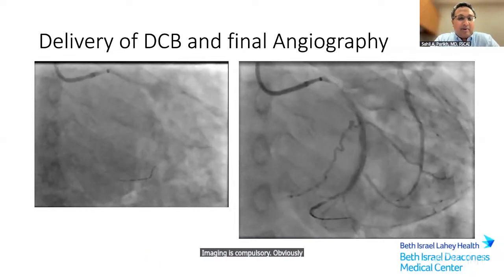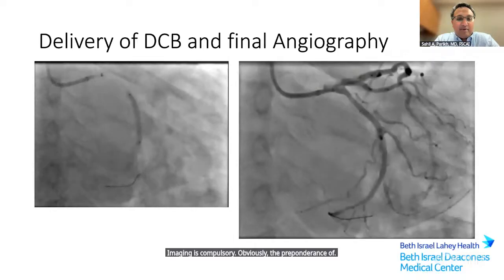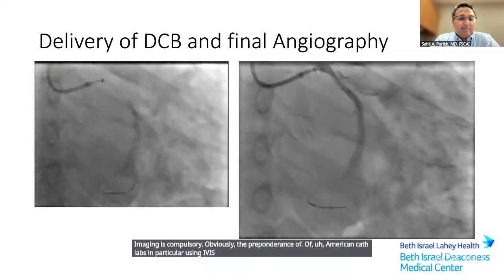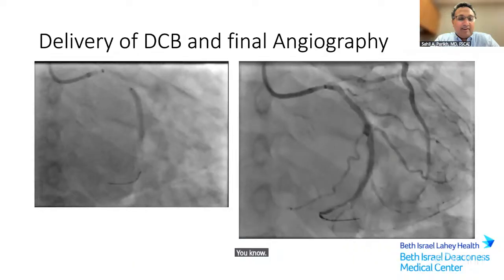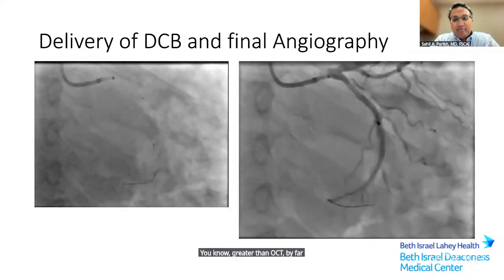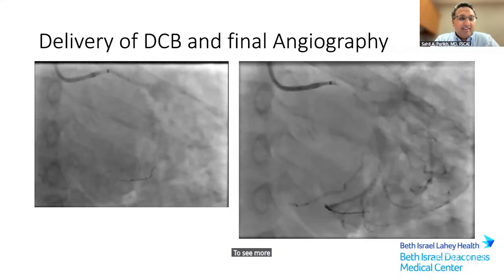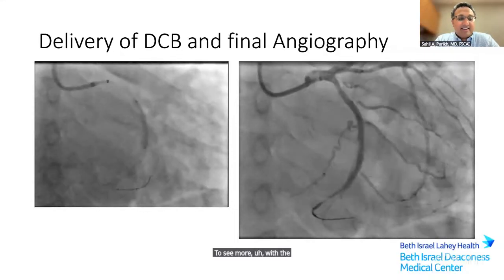All right, it's a worthwhile conversation, because I think that in the setting of ISR, imaging is compulsory. Obviously, the preponderance of American cath labs in particular are using IVUS, greater than OCT by far. But there clearly are opportunities to see more with the higher resolution technique.